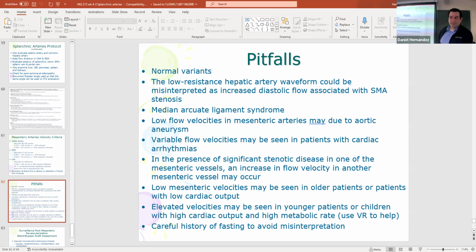That's when they're hooked up to that one machine, right? An aortic balloon pump. If they have an aortic balloon pump, it's going to look really funky. Chances are they're probably not too worried about this at this point. Well, maybe, I mean, if it's acute mesenteric ischemia, they're getting a CT. With chronic mesenteric ischemia, if they have an aortic balloon pump, they have heart issues going on, so they're more worried about taking care of that, then they'll do this at another time.